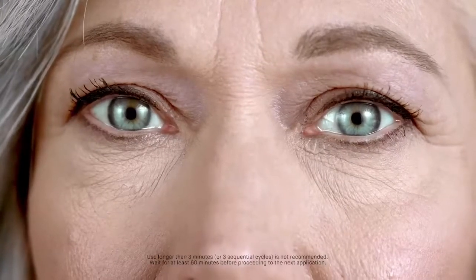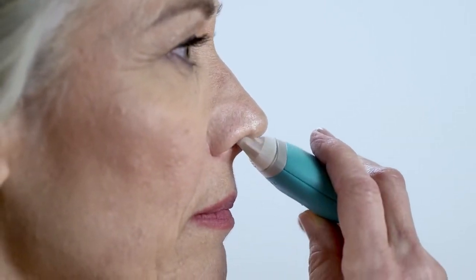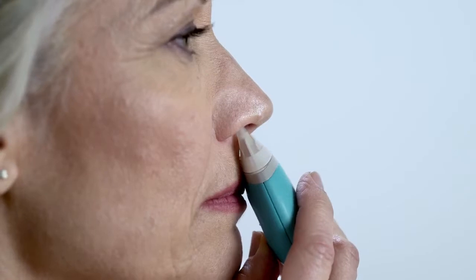Hold this position for no more than a minute or until you can feel tears forming. Once you notice tears pooling in your eyes, you've successfully used the device. Your tears will only coat the surface of your eyes — tears will not run down your face. If you feel slight resistance when inserting the tip, try inserting it on a more horizontal angle as far as is comfortable, then TrueTear Tilt.